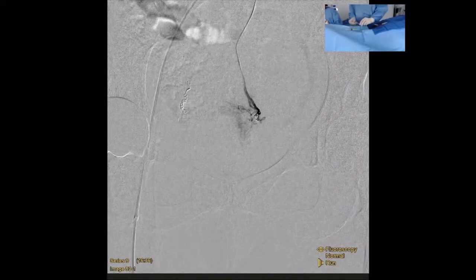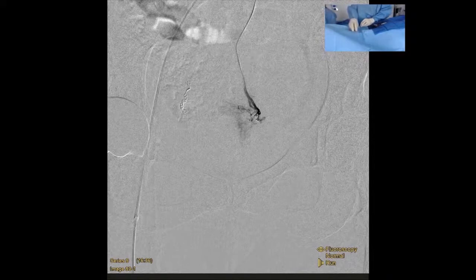I will take one more, just for more long-term inclusion, of course. But I will say fibers on coils. Why don't you give me your thoughts on coils with and coils without? I prefer fibers. Coils are, for the most part, not mechanically occluding. They're creating thrombus that's going to occlude. Although there are some technologies out there that are trying other things, my greatest experience is with fiber coils, and that's my bread and butter.